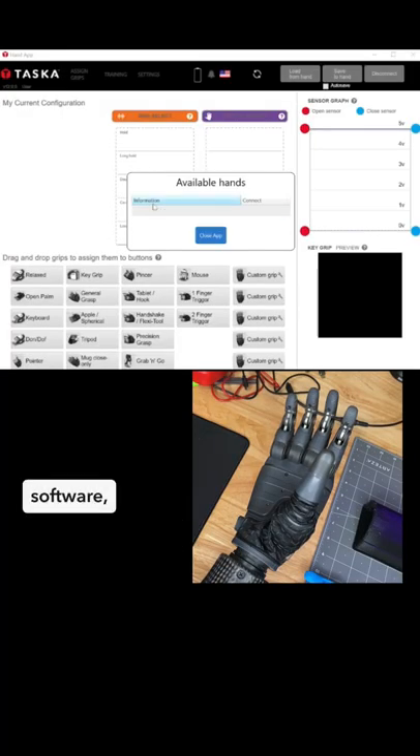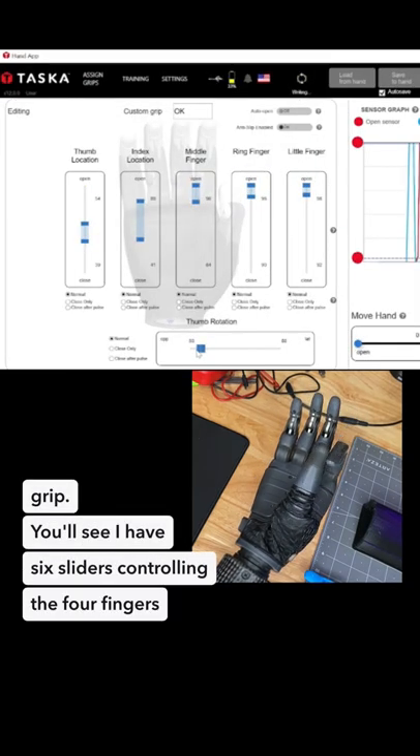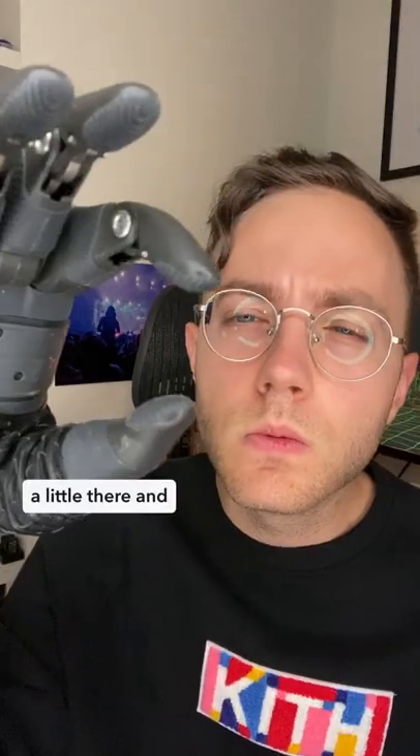So I boot up the software, connect this thing with Bluetooth, and move to the offending grip. You'll see I have six sliders controlling the four fingers, and two for the thumb since it moves in two dimensions. It turns out the thumb's lateral movement was the issue. A little tweak here, a little there, and I've got a perfect pinch.